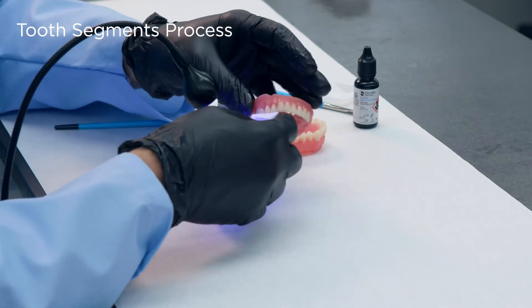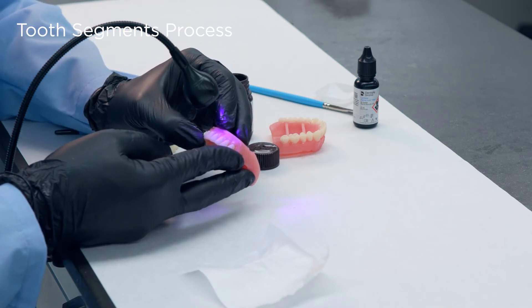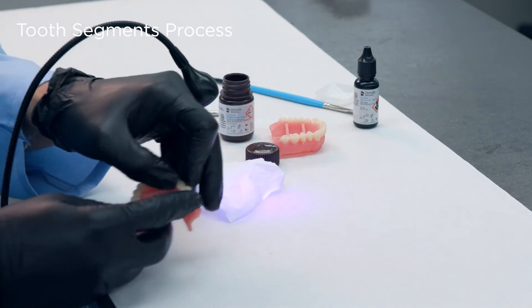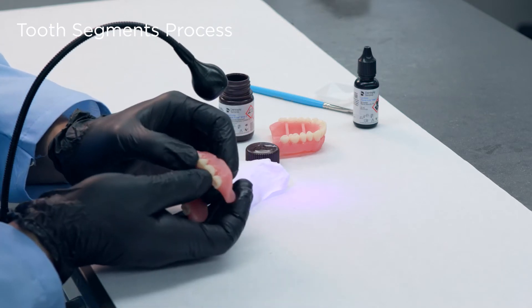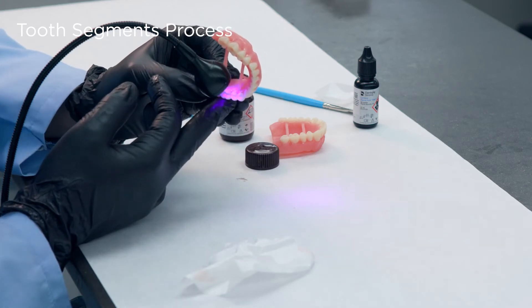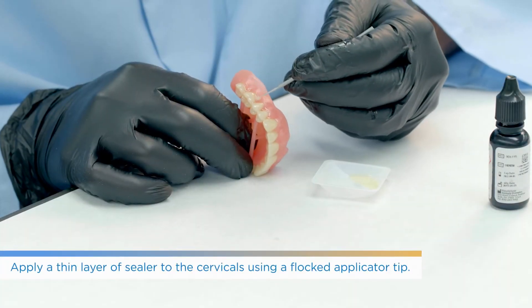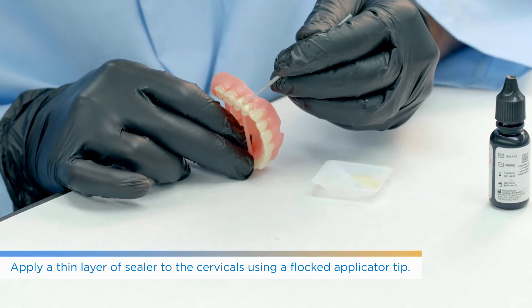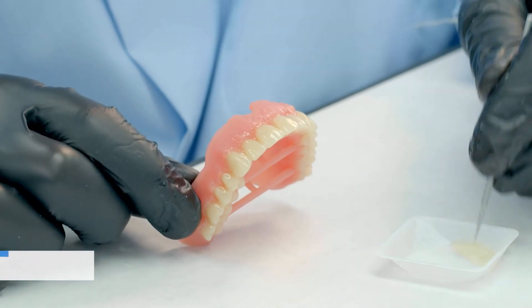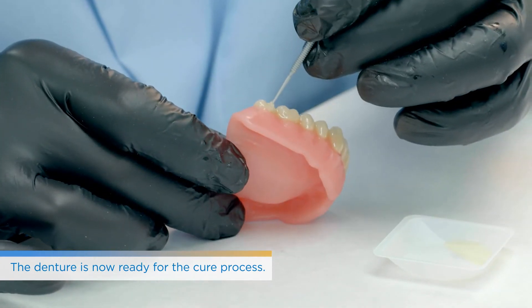Repeat that process for as many segments as you have for the arch. You'll quickly learn how much material to use for Fuse Step 2 — you don't have to use too much, but certainly don't be too thin in that area because it is the main bonding agent. Then Fuse Step 3 — same rules apply as with IPN 3D teeth. Use the micro brush on the cervical area around the margins, going around the marginal area on both the buccal and lingual. Then it's ready for the curing process in the designated Dentsply Sirona curing unit.